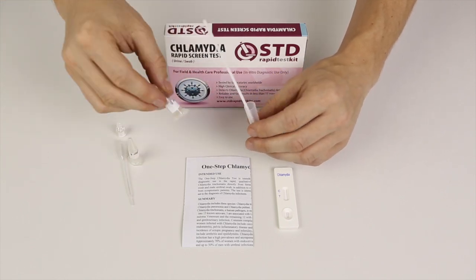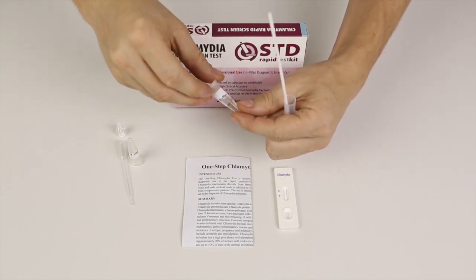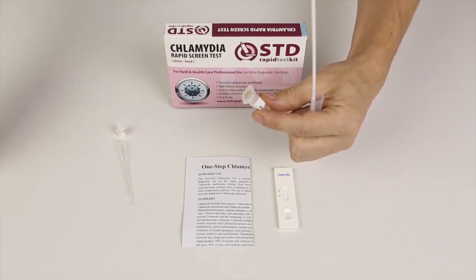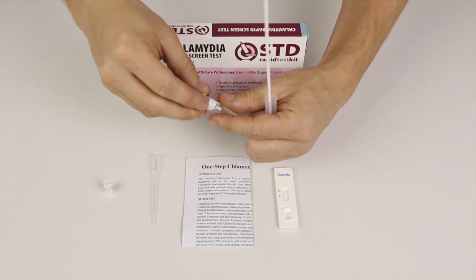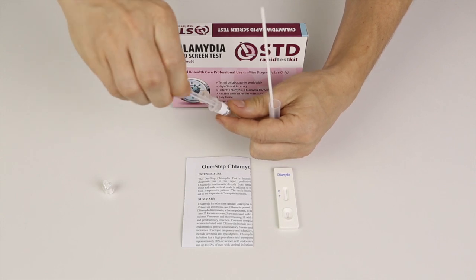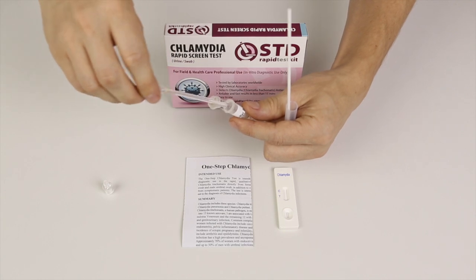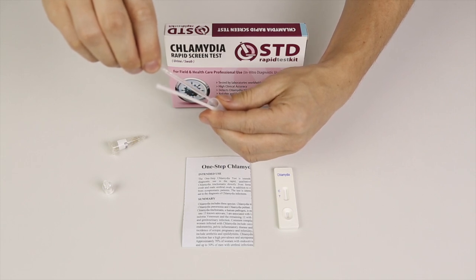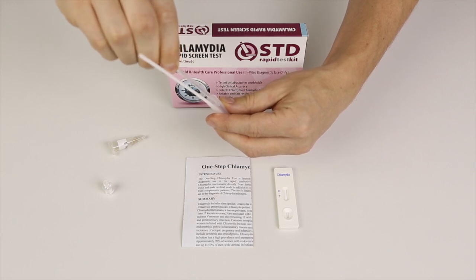The next step is to use buffer B. I'll remove the cap from buffer B and draw around nine drops out of it, putting that into the sample — one, two, three, four, five, six, seven, eight, nine.